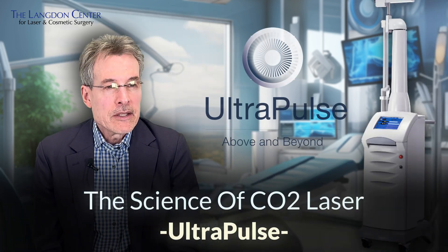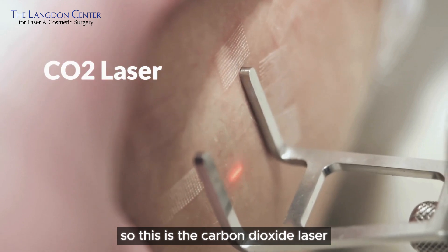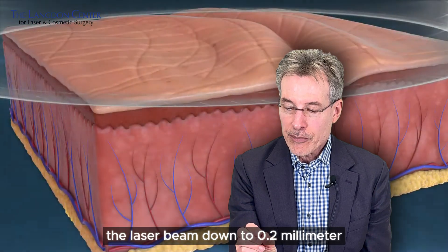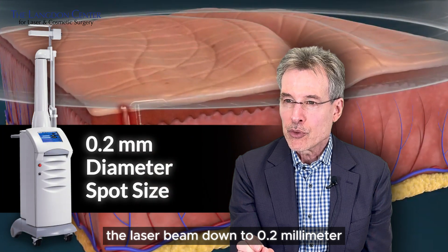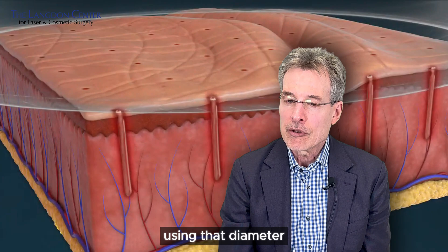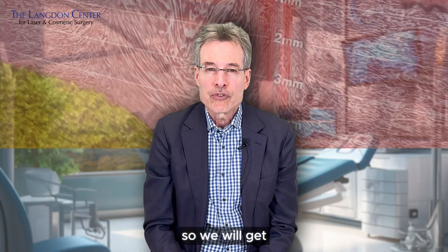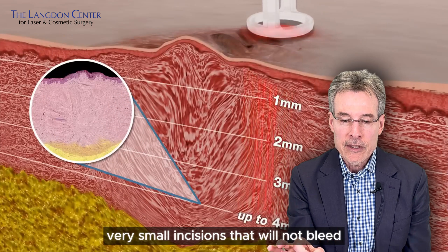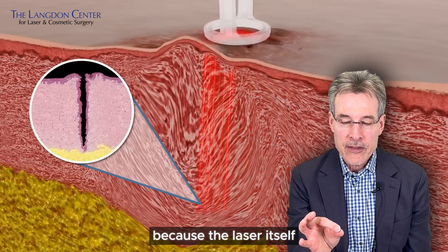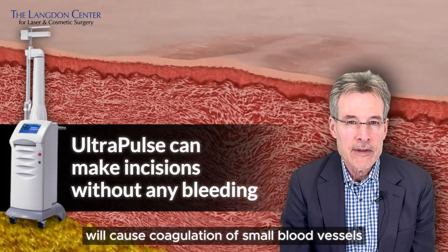The UltraPulse is one of my favorite lasers — it's a carbon dioxide laser. We can very precisely focus the laser beam down to a 0.2 millimeter diameter spot size. Using that diameter, we can actually make an incision instead of using a scalpel, and the incisions will not bleed because the laser itself causes coagulation of small blood vessels.